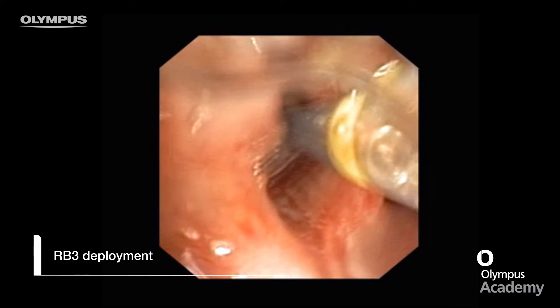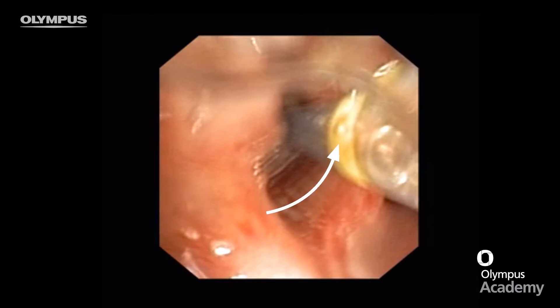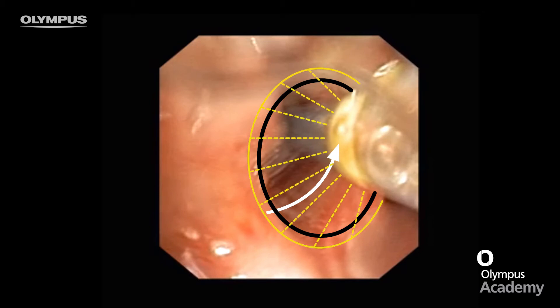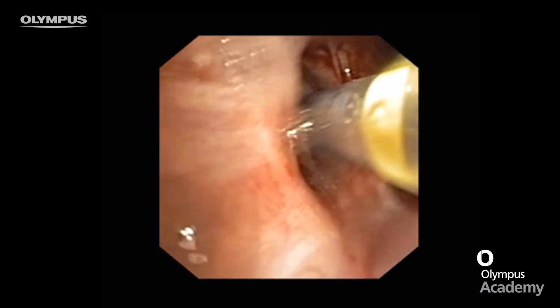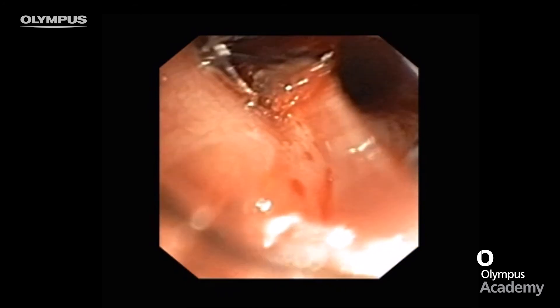The catheter is introduced beyond the target location and then drawn back into position using the yellow line as a guide. The yellow line indicates where the most proximal part of the valve umbrella is positioned, which should align with the target area of the segment. It is important to position the yellow line a couple of millimetres more proximally than the desired site, because the valve umbrella will settle slightly more distally over time. Once in position, I retract the catheter into the bronchoscope, leaving the valve in the airway.